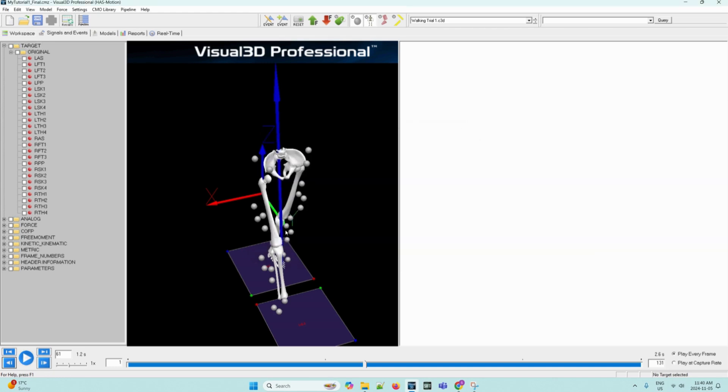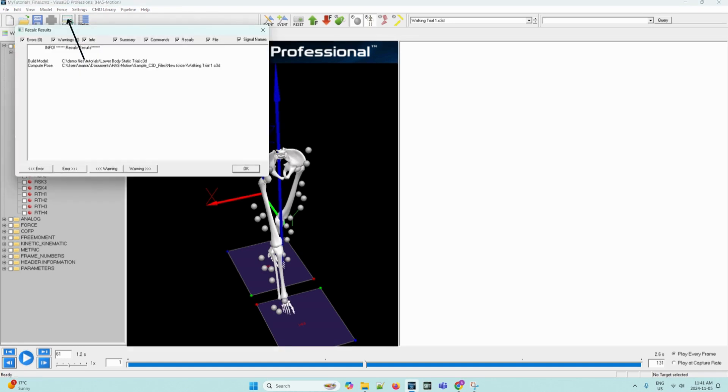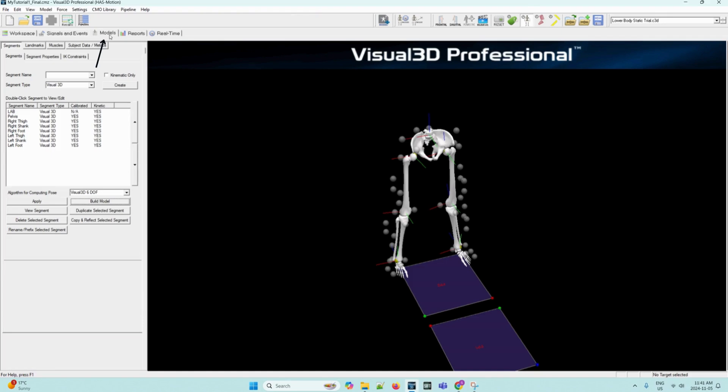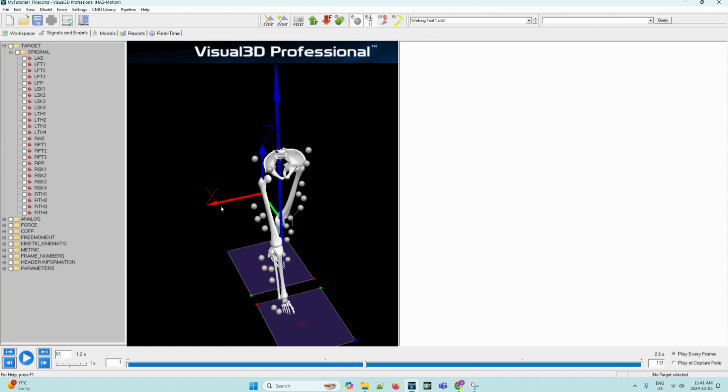The data file has now been corrected. However, the workspace has not been updated yet, so the segment will not appear in the animation. To get this segment to reappear, we need to get Visual 3D to recalculate the model. There are two options of ways that we can do this. The first is to click the Recalc button on the toolbar, here, and as we can see, the foot has popped up now. The second is to force the recalculation by switching to the Model Building tab and clicking on Build Model. Either option you choose, the 3D figure will display the missing foot once the recalculation is complete.